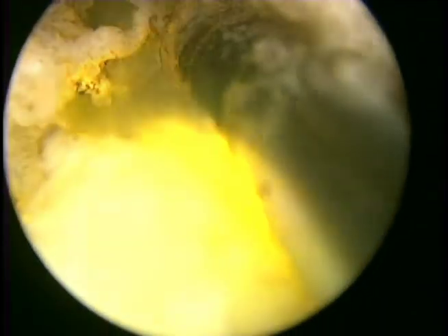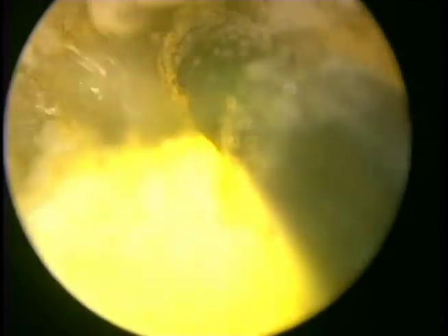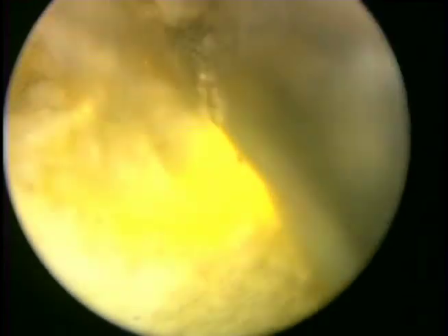It should also be noted that all patients undergoing this procedure should have cystoscopy and a transrectal ultrasound in order to not be surprised, particularly in one's initial learning curve.